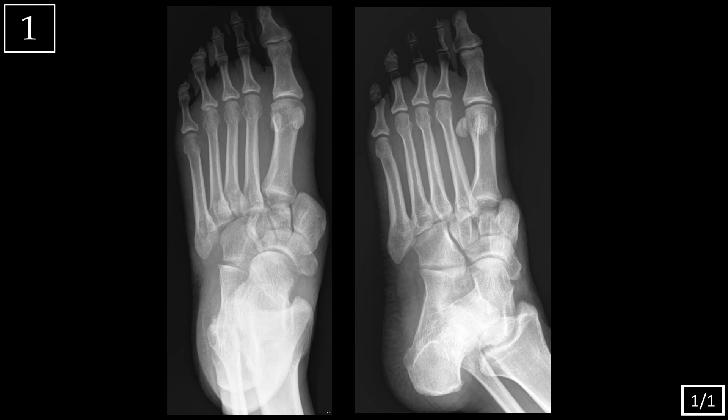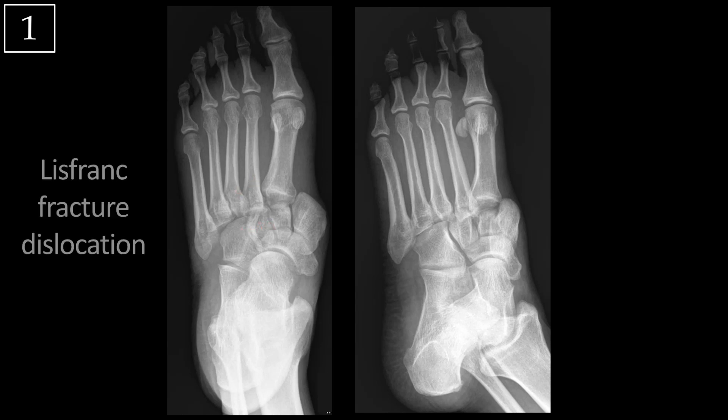Case one. Here we're looking at a frontal and an oblique view of the foot, and you can see that there's disruption at the junction between the tarsal bones of the midfoot and the metatarsals of the forefoot, and that's known as a Lisfranc fracture dislocation.